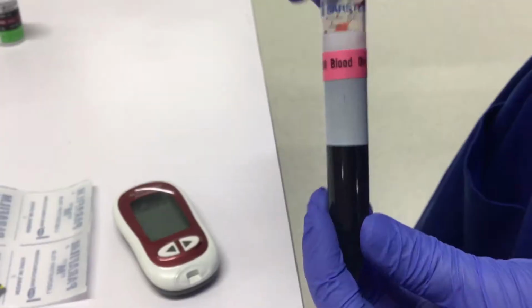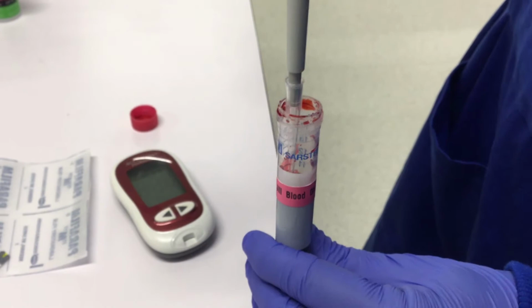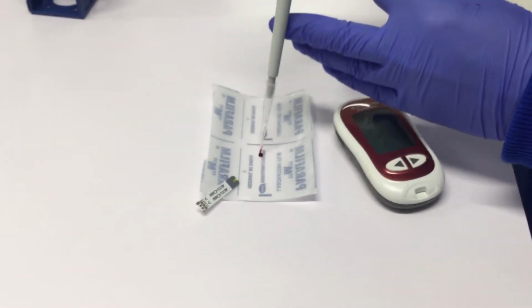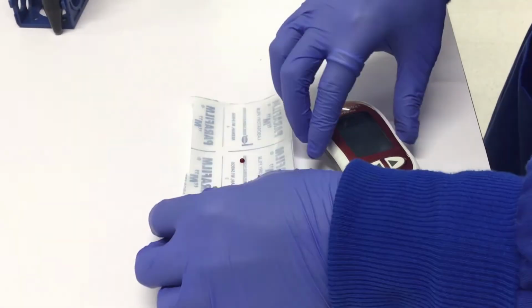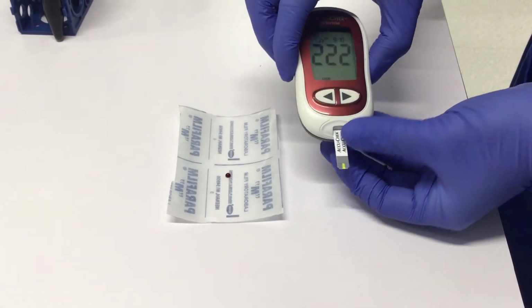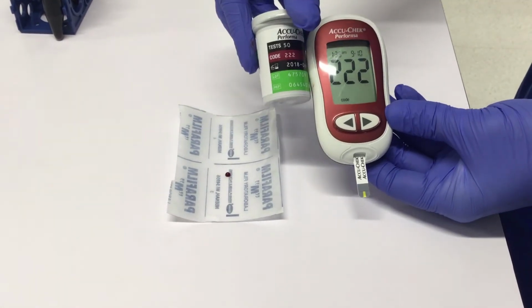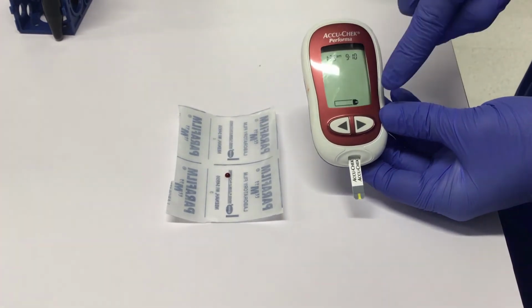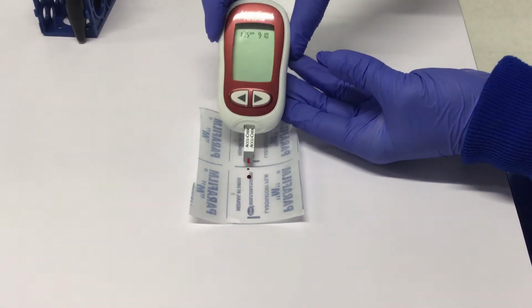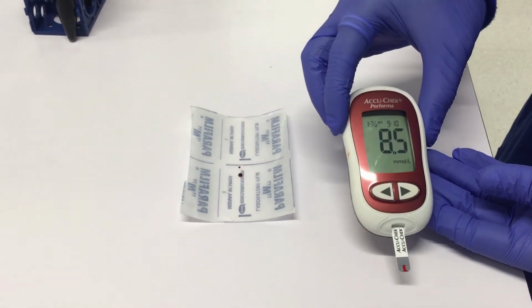So, Nick, using the glucometers, step us through what we're going to do. Sure. So firstly, you're going to get 6 microliters of your blood and make sure it's well shaken before you pipette it out. You're going to get a strip of parafilm and just drop your blood sample onto the parafilm. Then you're going to get the chip that goes into the glucometer. You're going to put it in and wait for the glucometer to flash up with numbers, and then just touch the end of the chip to the blood spot, and you should get an accurate reading from that.